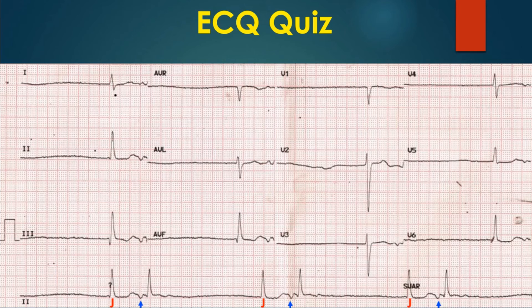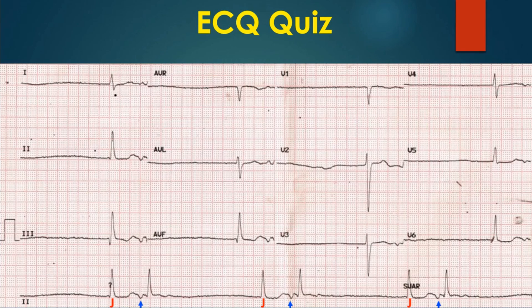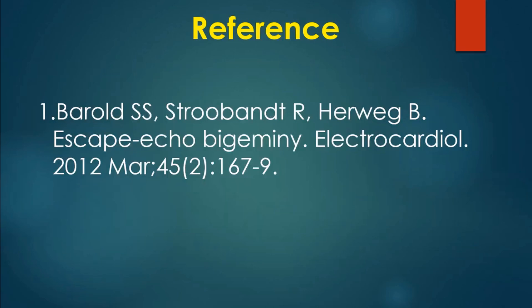In escape echo bigeminy, the second beat is an echo beat rather than a sinus beat. The inverted p-wave preceding the second QRS could be retrograde activation of the atrium from the preceding QRS. In that case, the initial QRS becomes a low junctional beat with a retrograde p-wave occurring after the QRS. This p-wave is then conducted back into the ventricles, producing the next beat — the echo beat — making this escape echo bigeminy, a very rare variety. Here is a journal reference on escape echo bigeminy.